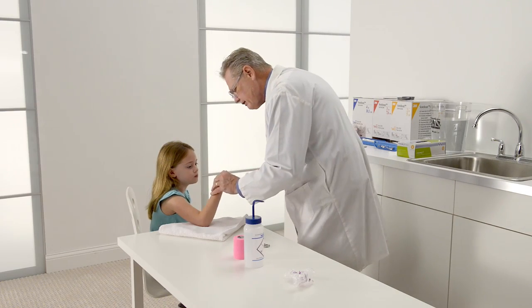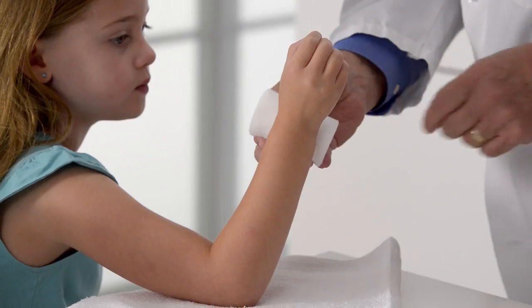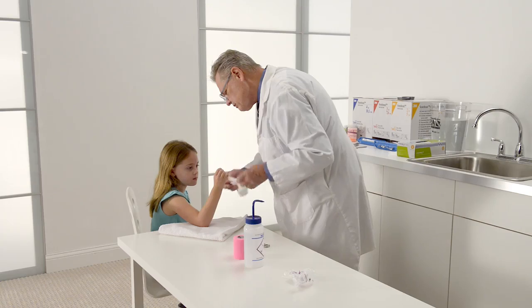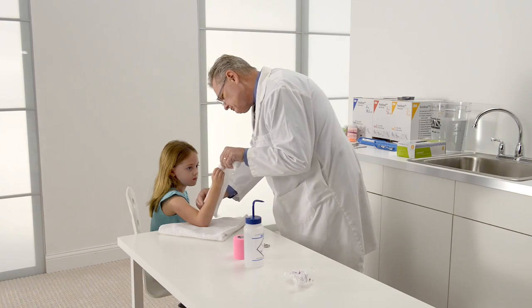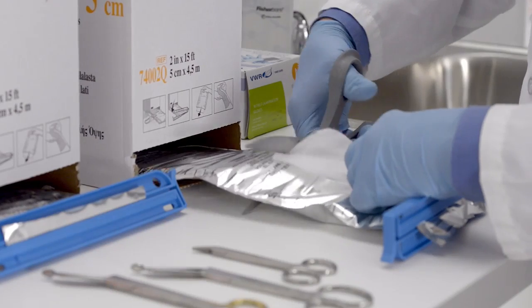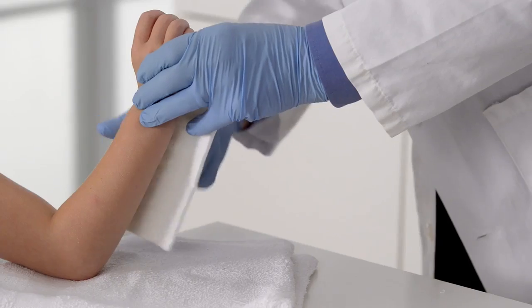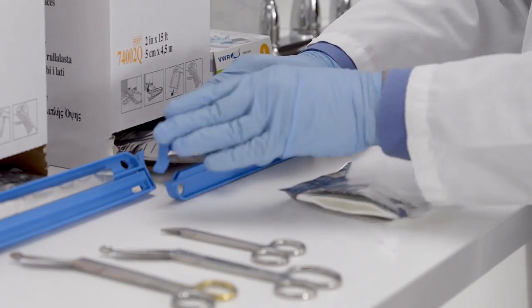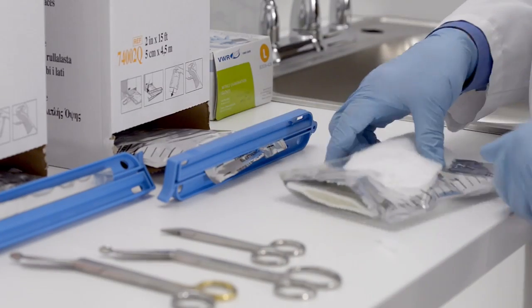Select an appropriate width of the 3M splinting material based on the size of the patient's wrist. Material that is about 1 inch wider than the patient's wrist is a good rule of thumb. Measure and cut the splint so the length measures from the patient's elbow to the distal palmar crease. Reseal the splint roll packaging to avoid hardening the material.